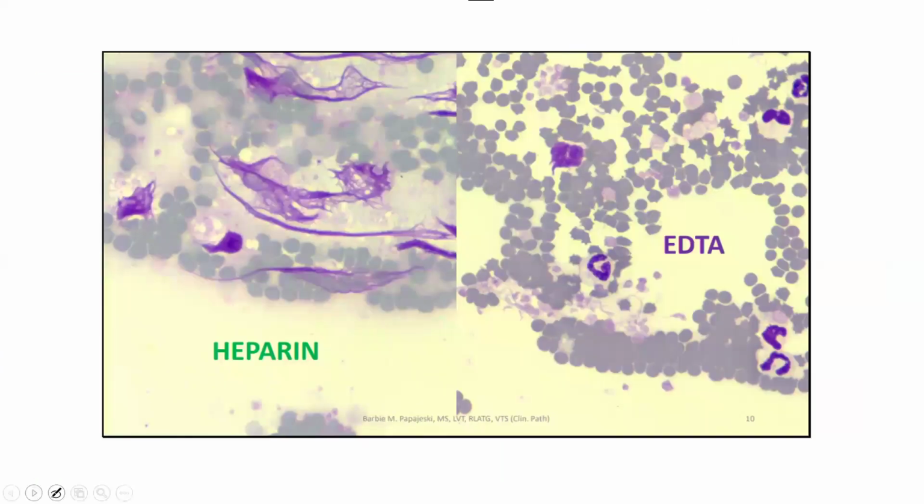Next, I'm going to show you a slide. Basically, you can see that when you have a blood sample with EDTA, you can see each individual cell. You can see the shape of the cell, like this is a complete spherocyte type cell, but these cells have different knob-like shapes. You can see clear-cut WBCs, RBCs, each and everything.